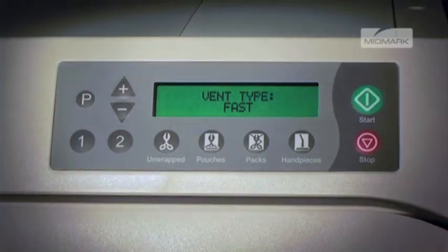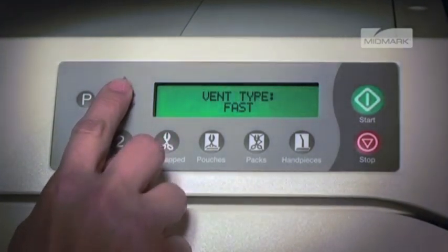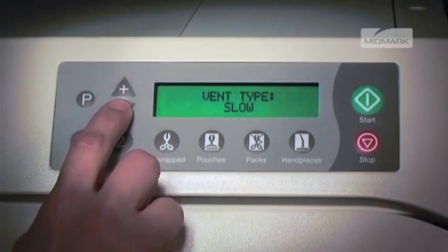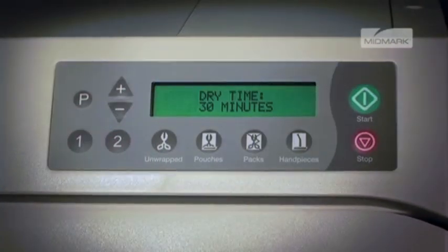The display will show vent type and the current value. Pushing the plus button sets it to fast vent — the vent will open fully. Pushing the minus button sets it to slow vent — the vent will open for a fraction of a second, once per minute, until the chamber is vented.